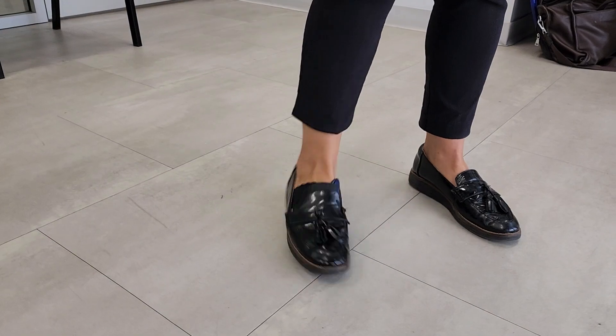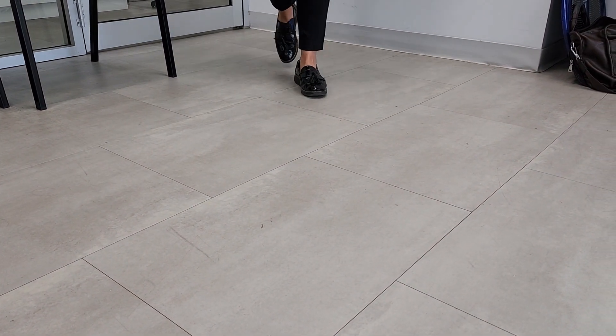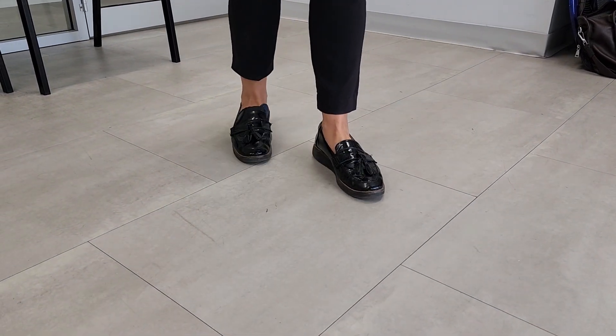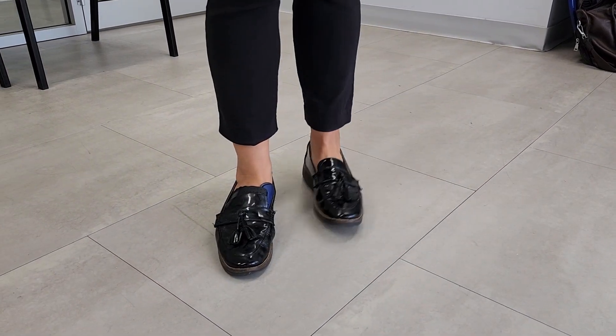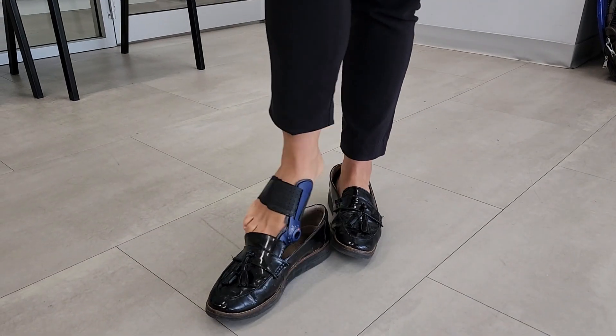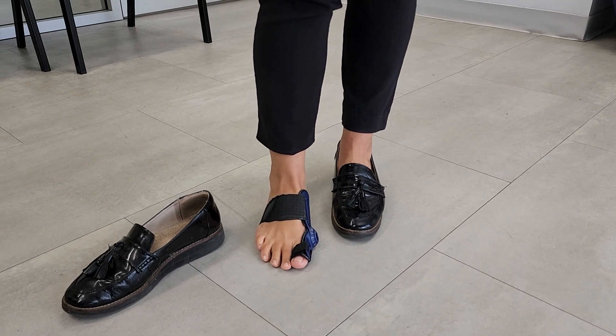So walk around for me and just tell me... Wow, that actually feels really comfortable. And it is splinting the joint — yeah, it splinted the joint. Fantastic. So there you go. If you've got a first MTP joint injury and you need to splint it, you can consider using this Valulock 2 brace. Thanks.